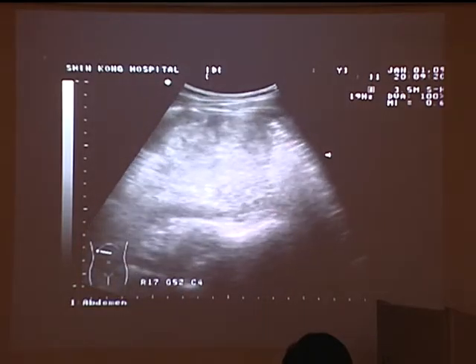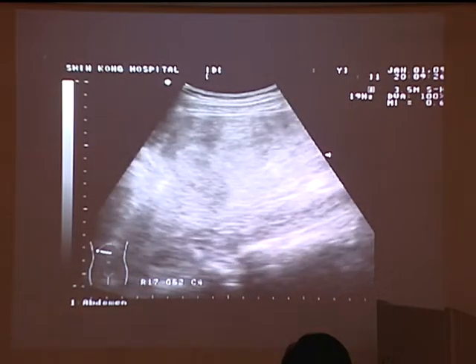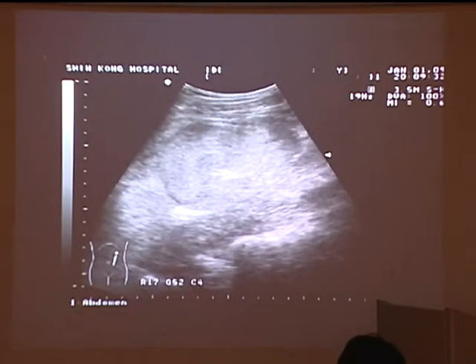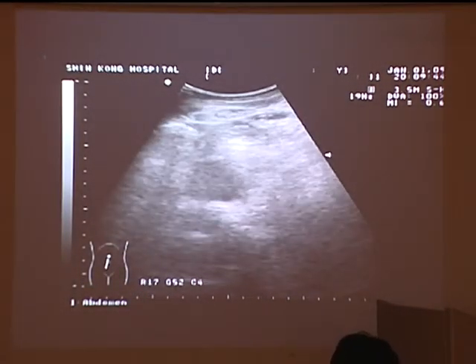You can see the pelvic ring and the iliac muscle will be shown here. Iliac muscle. Okay, what's this? There's a lot of hematoma in this retroperitoneal region. The aorta ruptured maybe several hours ago or yesterday. But maybe he's a little lucky because he's not dead at that time.